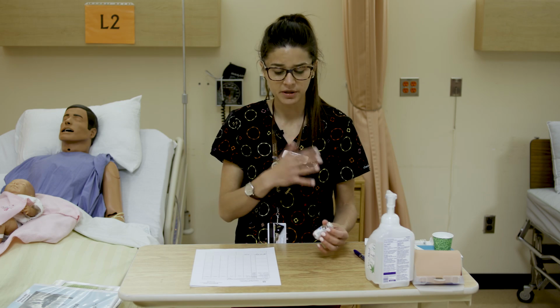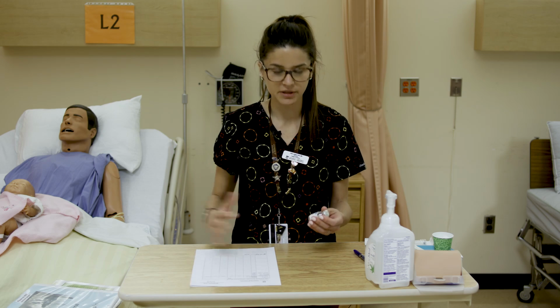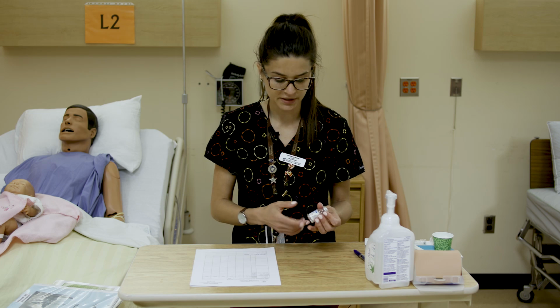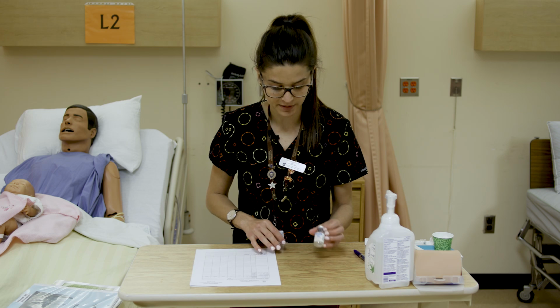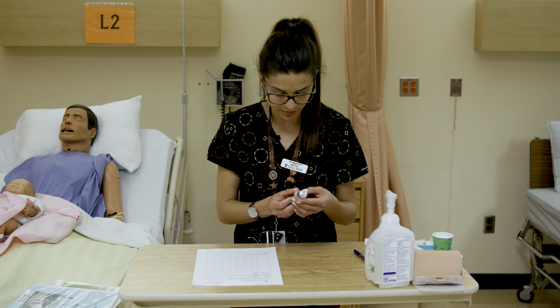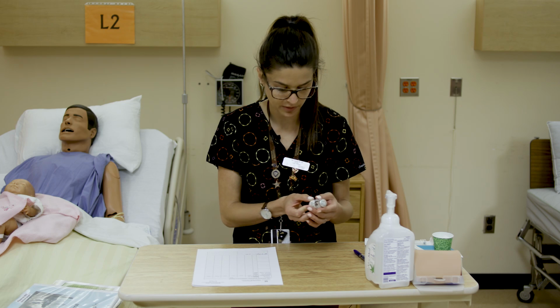Reconstitution is most commonly done with IV medication, so it's something you'll get into more later on. But it can be required for certain IM injections. It's not as common, but it's a good concept to understand. So we have here ampicillin for injection, and we want to make sure that it says right here, IM or IV use only.